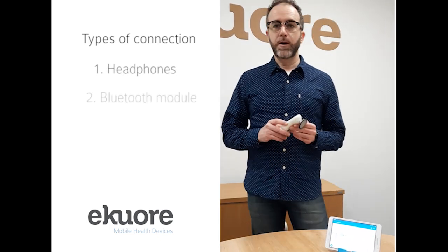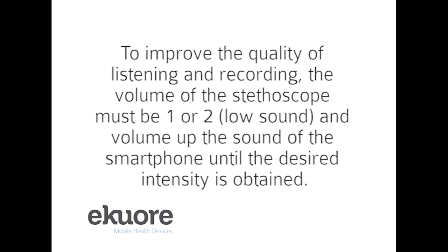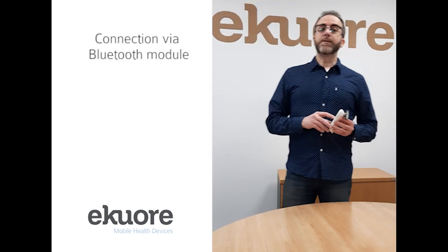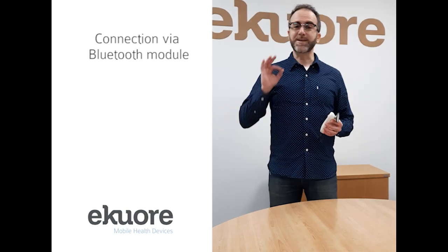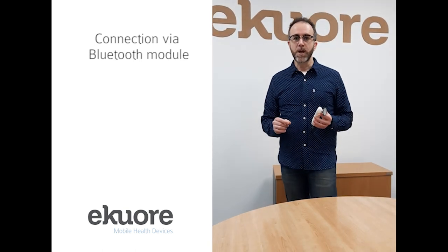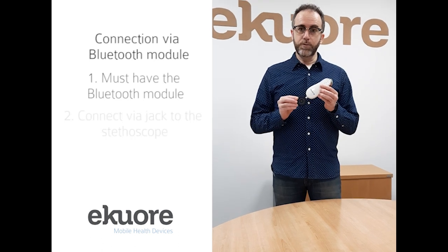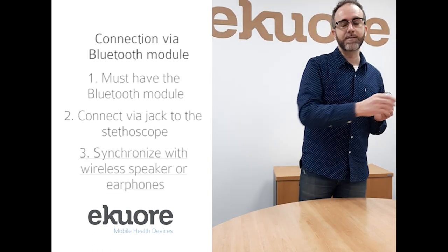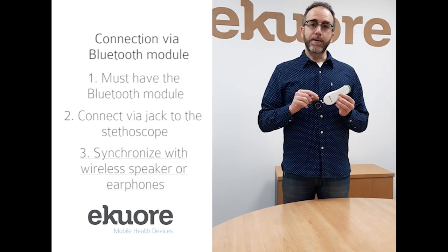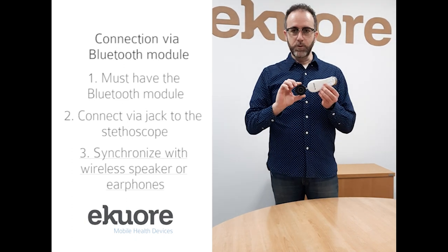We have different options to connect our EqualPROD depending on our requirements. If we don't need to record the auscultation for future follow-up of the patient or for future studies and we just need to make an auscultation in real time, we have the option of adding our Bluetooth transmitter. With this Bluetooth transmitter you can send the sound directly to another device such as a wireless headset or wireless earbuds, and you can make this real-time auscultation from up to 10 meters distance, which is what the Bluetooth transmission allows.